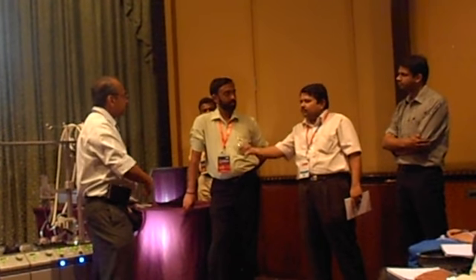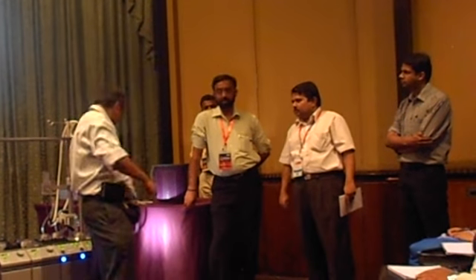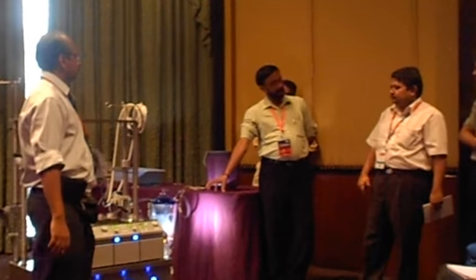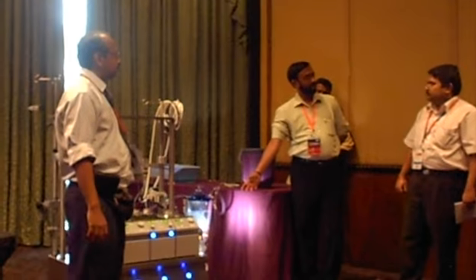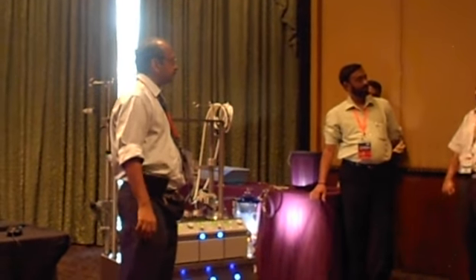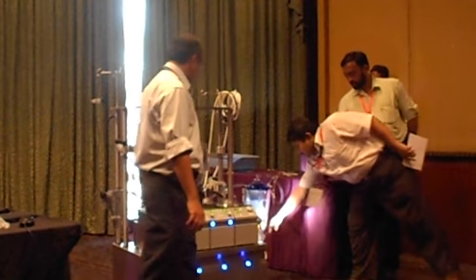But how to give it in the new reservoir? You will change only this portion. This is only around 100 ml. In pediatrics it is 100 or 110 ml. So only that part will change. Okay, but he has to do it. Yeah, he can.